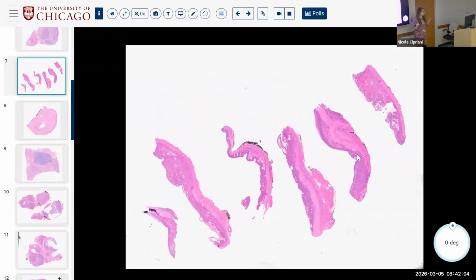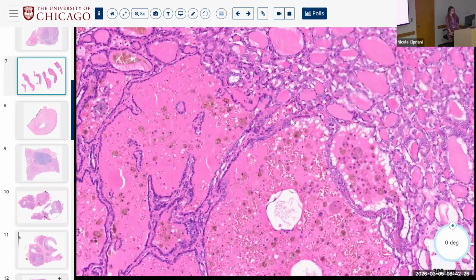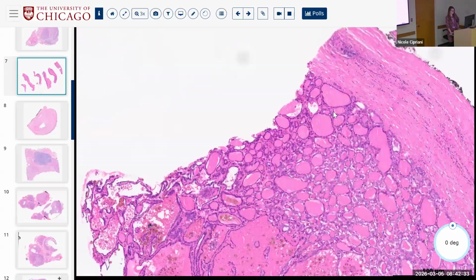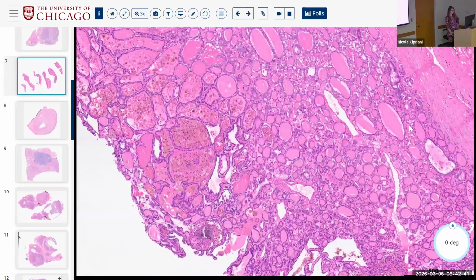Maybe they cut it fresh, I don't know. This is why we don't cut our thyroids fresh, right? Because we don't like this slippage and folding of tissue planes. We like good intact sections. These are a little bit slippy and a little bit foldy. Okay. So we have a capsule with calx, and we now have tumor morphology. Small, thin papillae, mostly follicles.